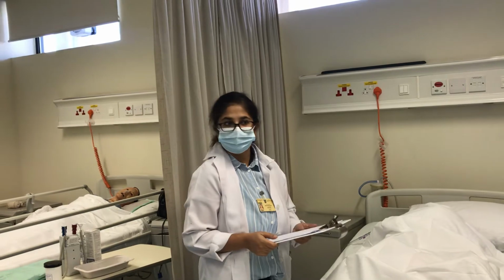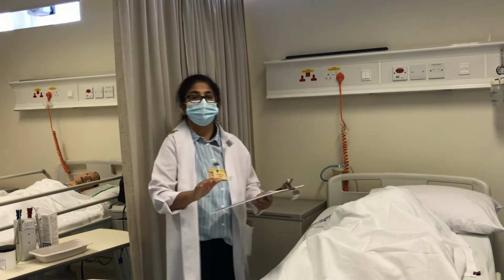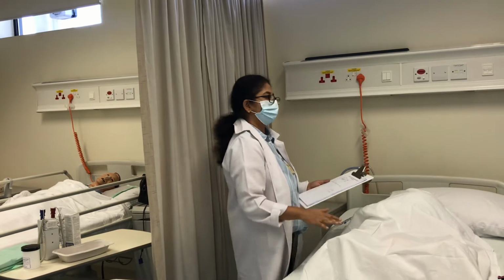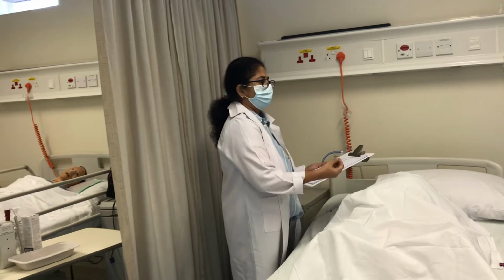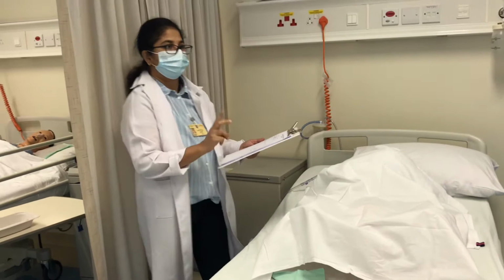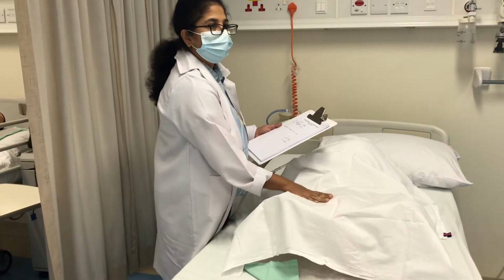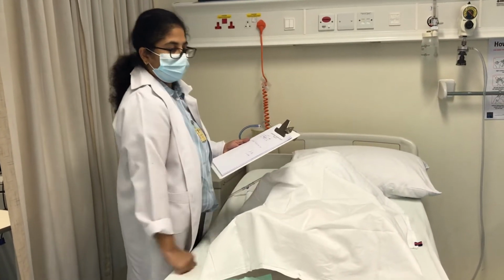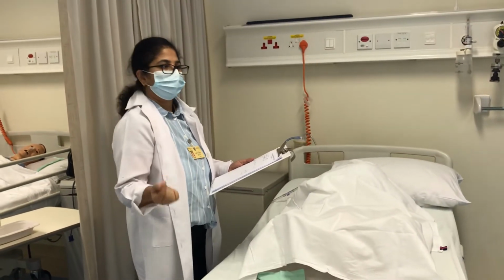So after getting the consent, I need to assess whether the patient is able to lie down in a supine position, because some patients are having breathing difficulty. And for this procedure, we are going to keep the patient completely on a flat position. At least low Fowler's is also all right. So that is one of the assessments we need to see. Then we also will assess for bladder distension or discomfort. What else? I think those are the few things. And any allergy to the type of catheter we are using.